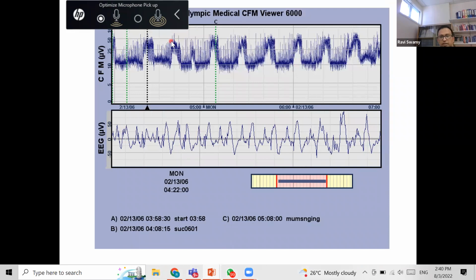Now, this one will be what we call as multiple seizures. These are all seizures. Okay. So the same thing, you'll confirm it on the normal EEG. Multiple spikes is seizures. But if you see here, it's above 5, above 10. So it looks like as if it's a normal trace. But I suspect this EEG has not been put properly. So as a result, the traces have all shifted up. But this is not a normal trace, because if you see so many seizures, this child has to be severely suppressed to have so many seizures.